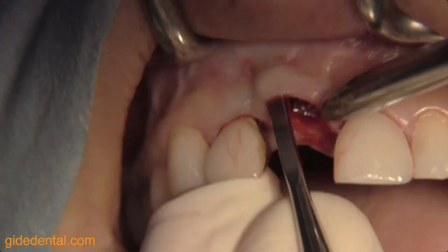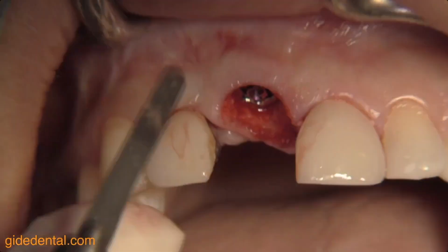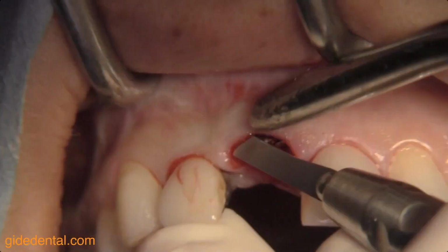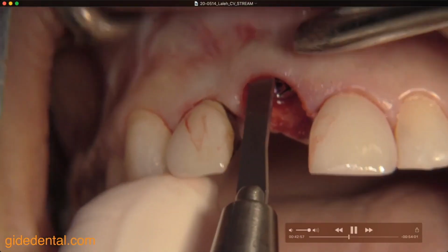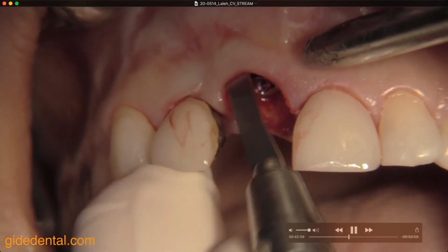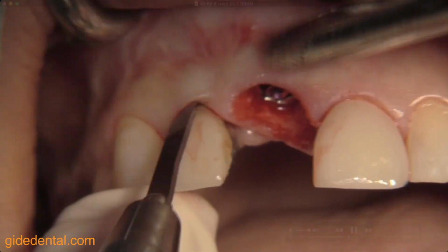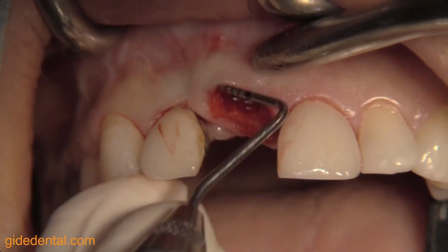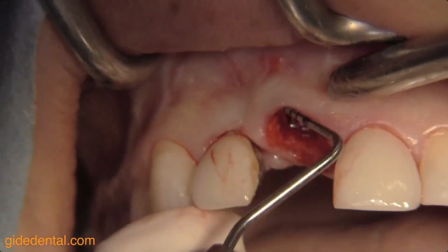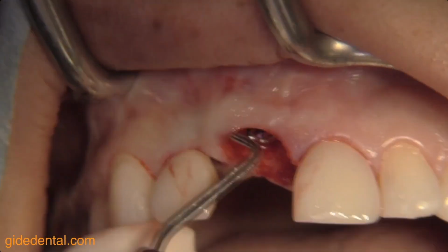And because the implant, which is 10 years old, you can see it's a little bit thin in that area, I'll thicken that as well. So this is a nice procedure. As you can see here, we're moving in with a gentle microsurgical blade. You have to be very careful so that you don't displace the papilla or cut the papilla. And then I'm actually using here, as you can see, just a simple periodontal probe to complete my tunneling procedure.